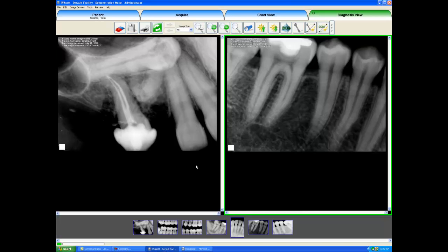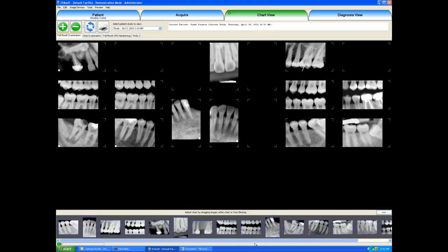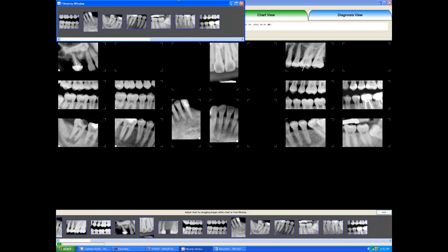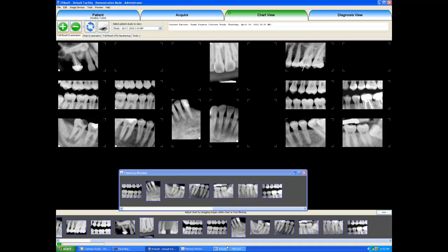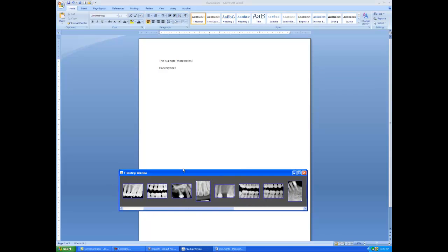Another thing we can do in Evasoft is come back to the chart view tab and right-click on the film strip. Not only can we float one image like what I just did with Keep on Top, but I can put the entire series on top of all other windows. I will right-click down here and select Create Film Strip Window. Now my film strip is a loose window. I can come back into Microsoft Word or any practice management software charting and look at my entire series as I'm taking notes. I can refer back to my images and move the chart around to look at more x-rays and keep on taking notes.